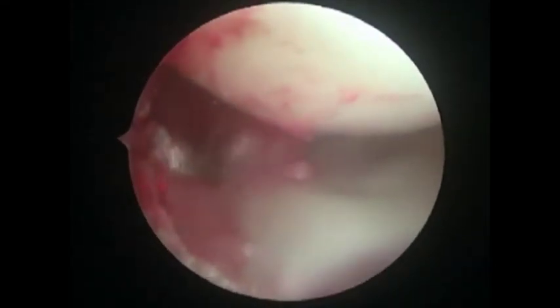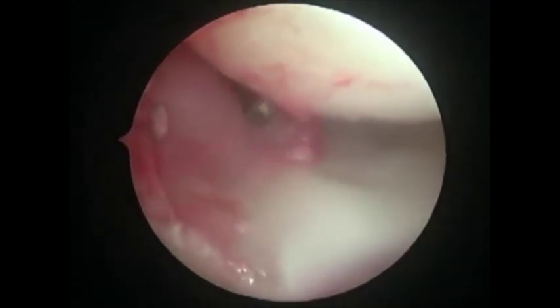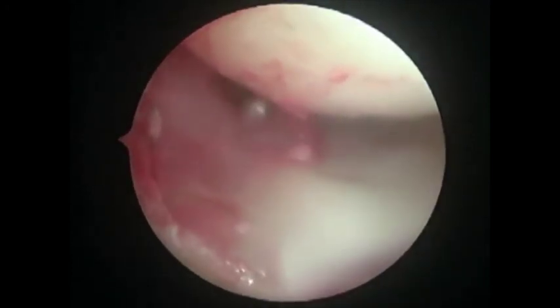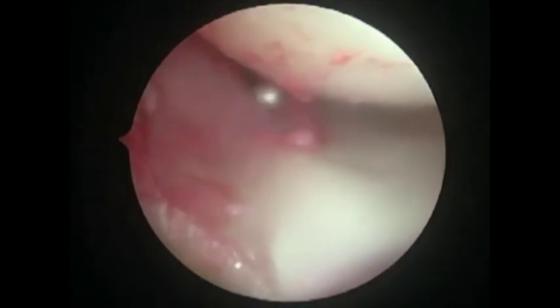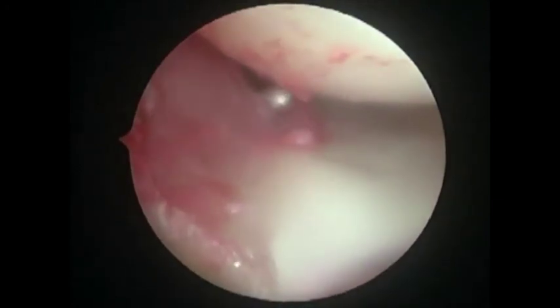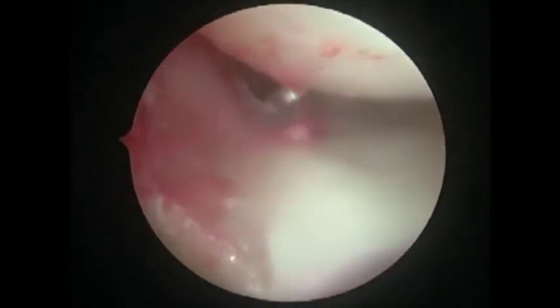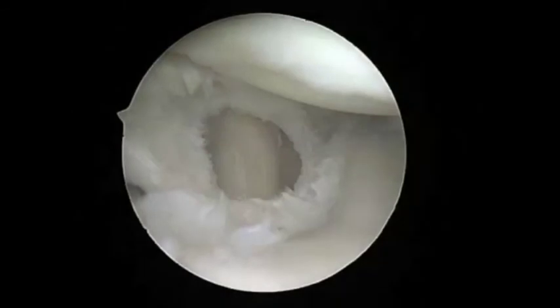The stalk and any remnants are removed meticulously. A portion of the adjacent wrist capsule may also be debrided along with the stalk. This eliminates the one-way valve effect and source for filling of the cyst, and also creates a new alternative pathway of least resistance.